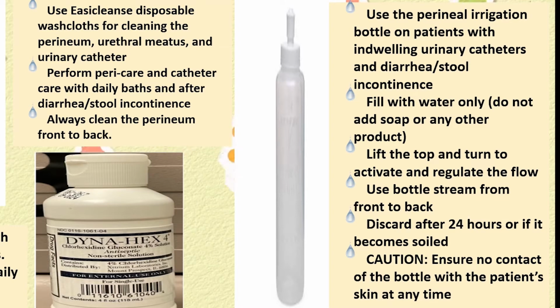We should lift the top and turn to activate and regulate the flow. Use the bottle stream from front to back and discard it after 24 hours or if it becomes soiled. A word of caution though, we should ensure no contact of the bottle with the patient's skin at any time.